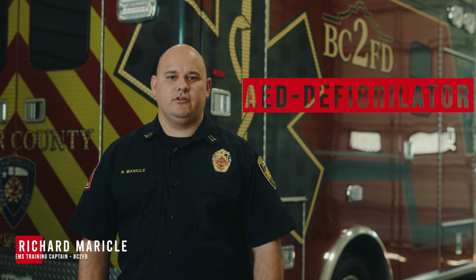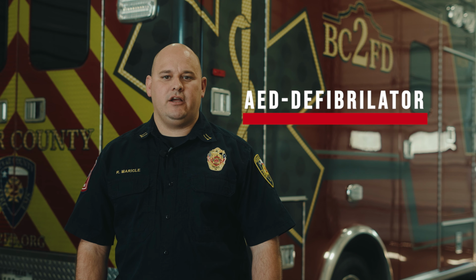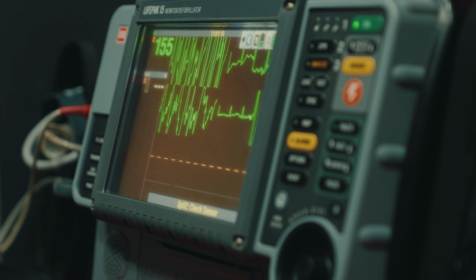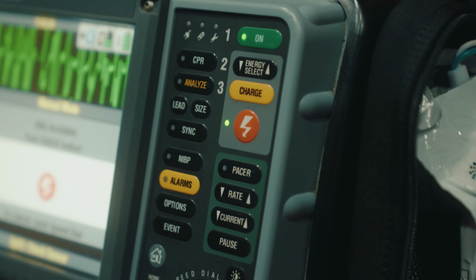Another important aspect of survival for cardiac arrest victims is the early use of an automated external defibrillator, or AED. Some patients become a victim of cardiac arrest due to a very specific type of irregular heart rhythm that prevents the heart from pumping blood effectively. The AED's purpose is to provide a shock to the heart, called a defibrillation, to stop this and return the heart back to its normal rhythm.